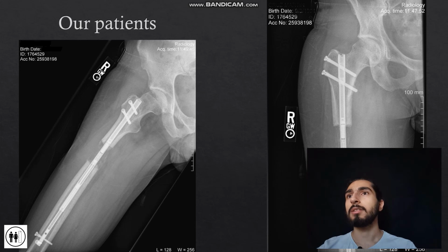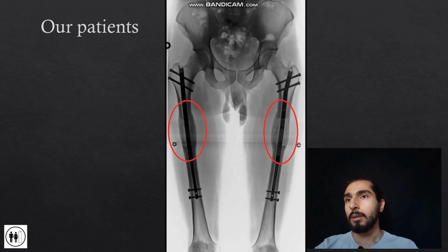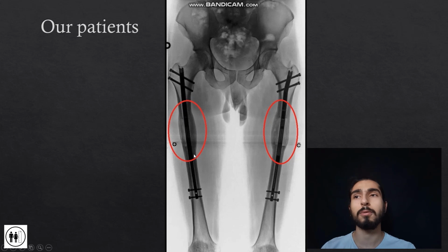Here it's the same patient, who has already performed around 6 centimeters of bone lengthening. It's a clearer image, so you can see the screws, the mechanism and everything. And this is another patient who increased his height by gaining 7 centimeters on the femurs. And this part is where the bone consolidation is happening. This weird balloon-like shape is bone consolidation, but it hasn't ended yet. When the bone consolidation completes, this part becomes more even and smooth, and it looks natural.